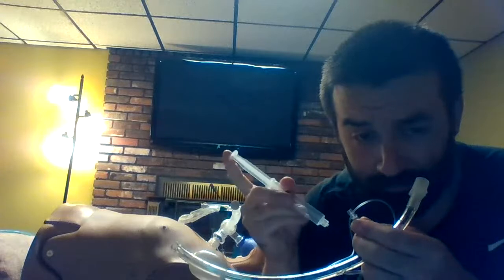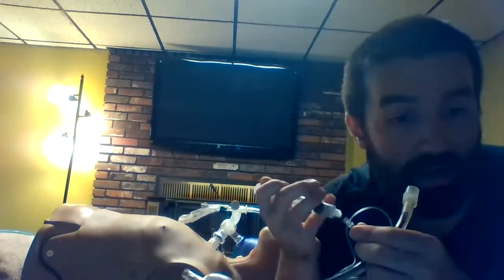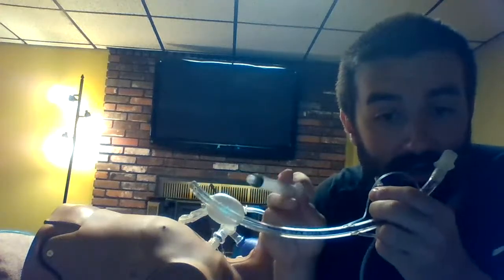Let's say I hook that up. I push my syringe. Nothing happens. I add air. I don't meet any resistance. My leak doesn't go away. I either got a hole in my cuff, or something's wrong with my pilot line.